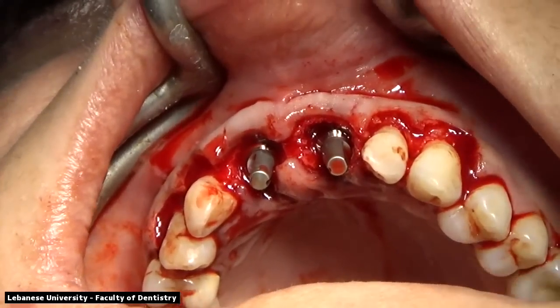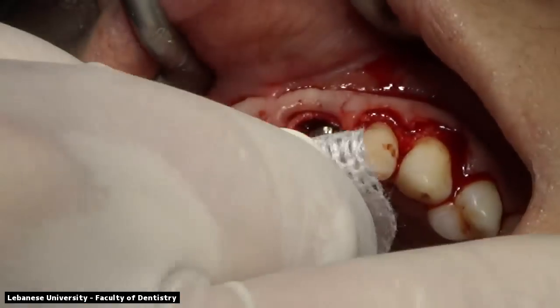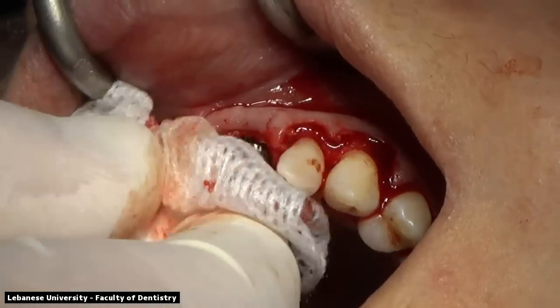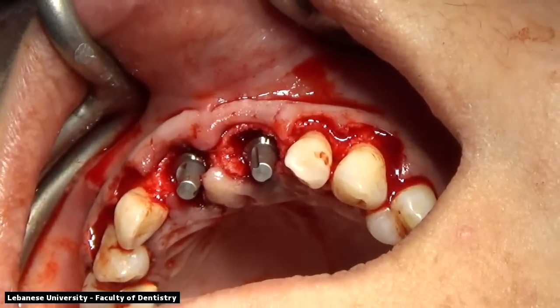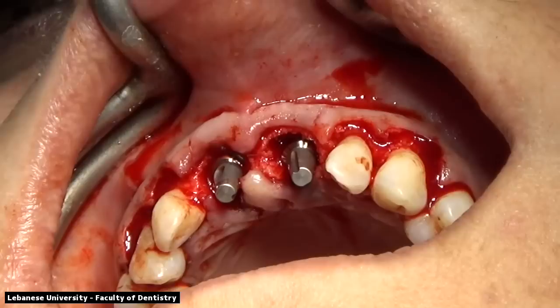Two straight abutments have been placed. The abutments are 5.5 millimeters in diameter. We can appreciate the parallelity of both abutments and the proper direction with the arc, the occlusal arc of the upper anterior teeth.